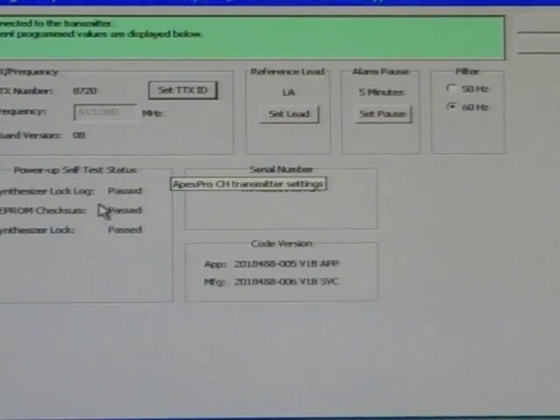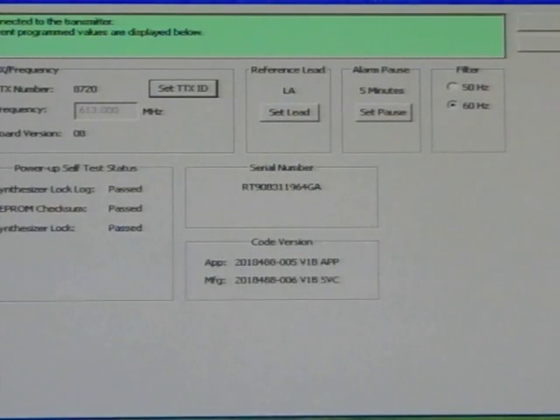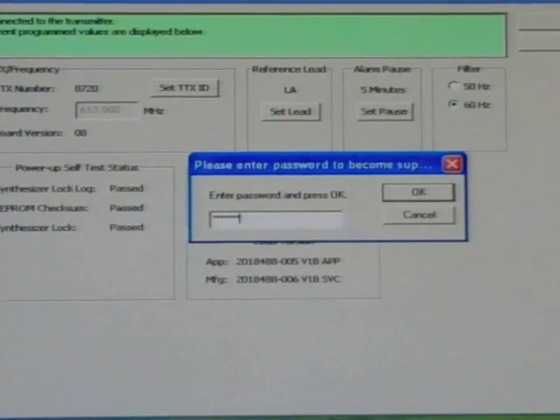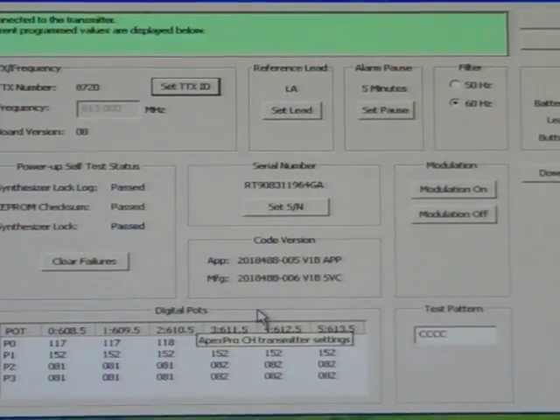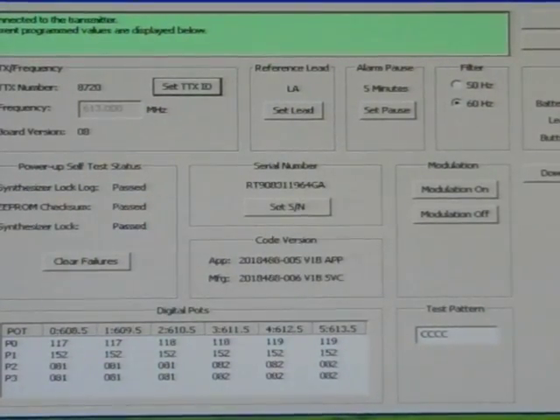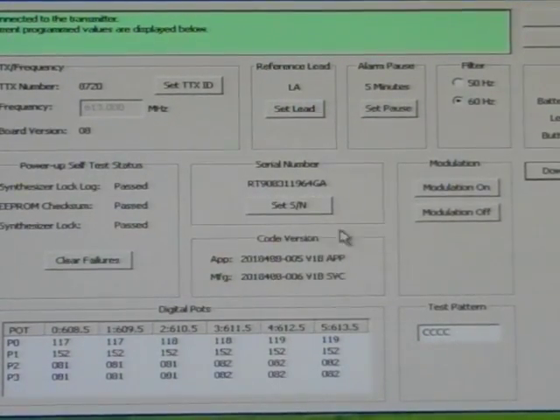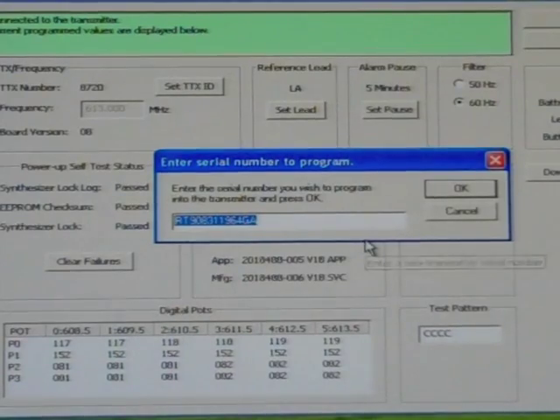If you need to get to clear failures, get into deeper programming, you go over here to your right-hand lower corner with this little clock. Click on it, enter in a password, which is MMS_APS. Enter it in, and you can see that you have a little more detailed programming that comes up on your screen. Here you can download your EEPROM code. If you've lost complete information, you can click this, and it will clear it out and reload.